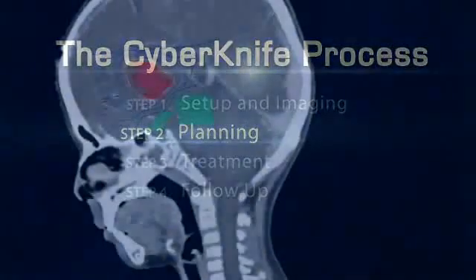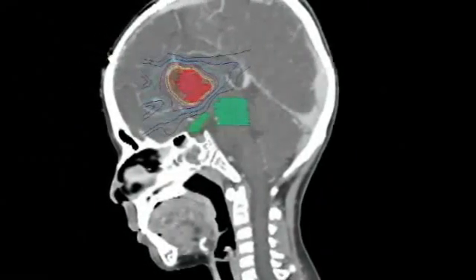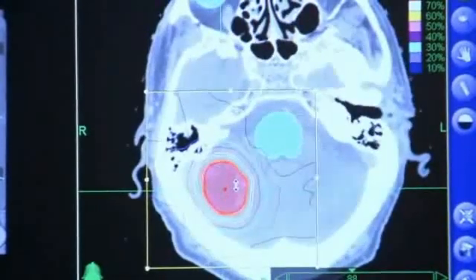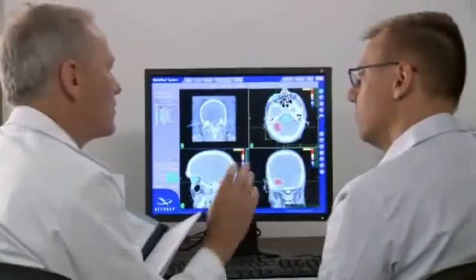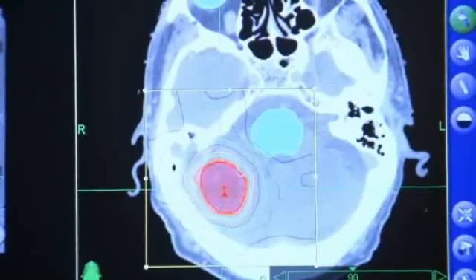During treatment planning, your relevant CT, MRI, or PET scan data will be downloaded into the CyberKnife system's treatment planning software. Your medical team will determine the size of the area being targeted by radiation, the radiation dose, and will identify critical structures where radiation should be minimized.